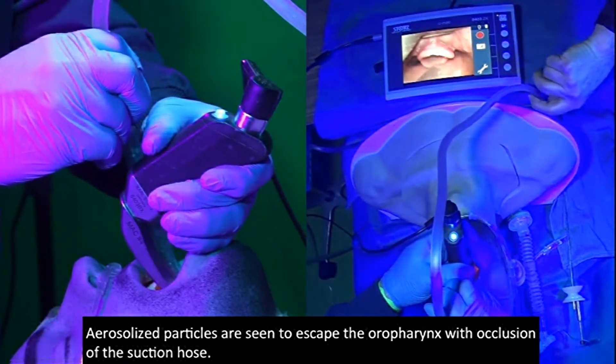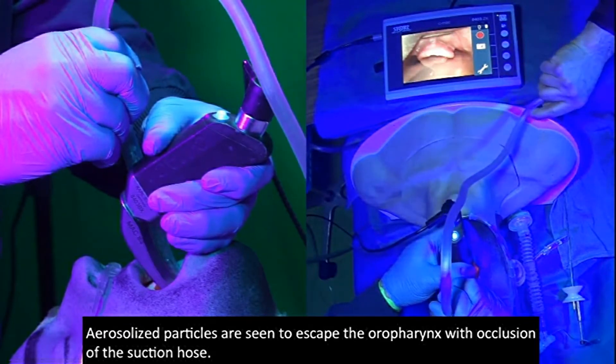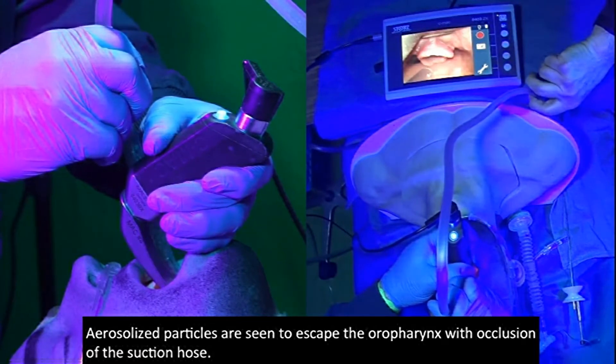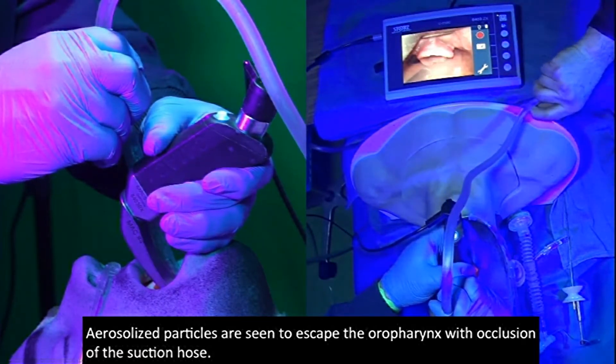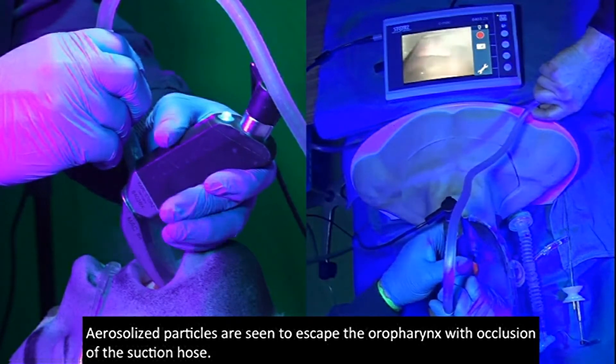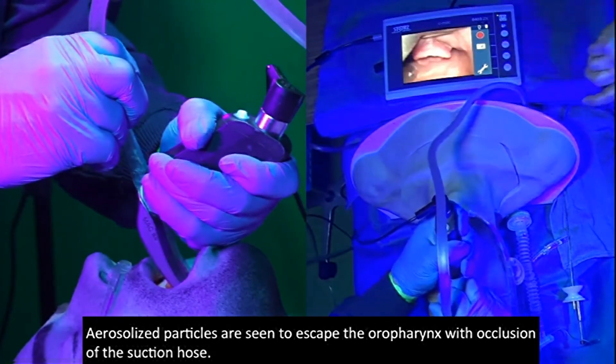Suction's on. I'm going to turn the suction off when I'm not seeing anything come out of the mouth, but I'm starting to see it come out of the mouth again, so suction's back on.